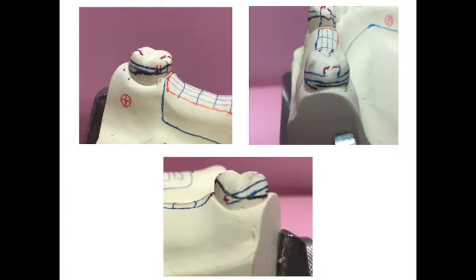When I look on the lingual, on the distal part, the survey line is lower than that, so I know I'm fine. I don't need to do any adjustment. When I look on the buccal, I think it's okay, because if I divide it into thirds, only the terminal third is under the survey line, the other 2 are above, so I'm okay. So I just need to do 2 vertical lines here on the lingual.